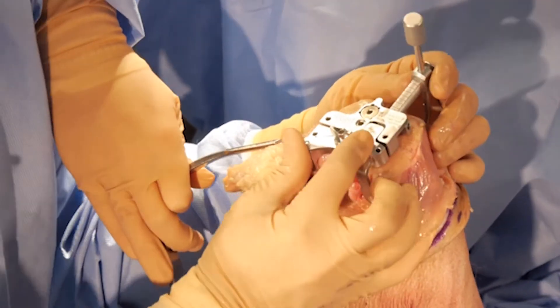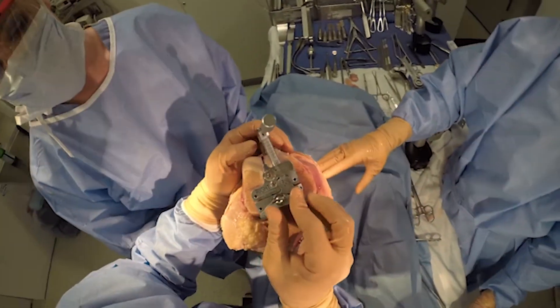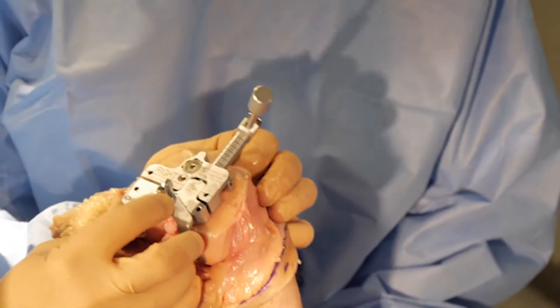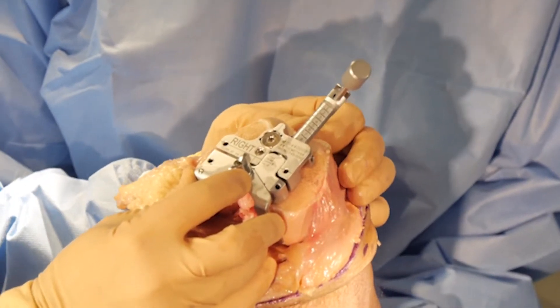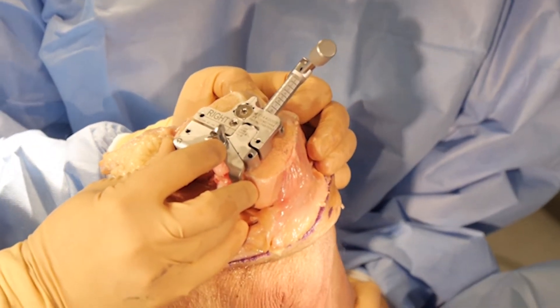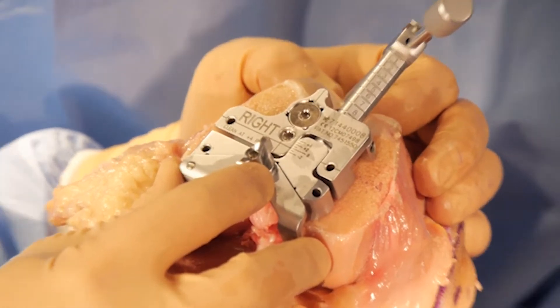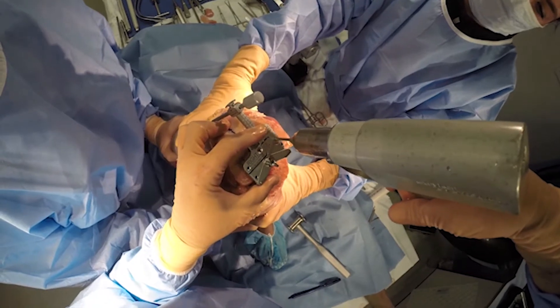This guide sits underneath the condyles, and you change the rotation of the guide so that it matches your AP axis as well as your surgical trans-epicondylar axis. I like that — it's parallel to the lines I made and I'm sizing around a size 7. This is a posterior referencing system, so the posterior condylar cut is always the same, but your anterior cut will change. If you're in between sizes, try the larger size first so you don't notch, then downsize if you can. Now I'll make my two holes for my 4-in-1 cutting guide.